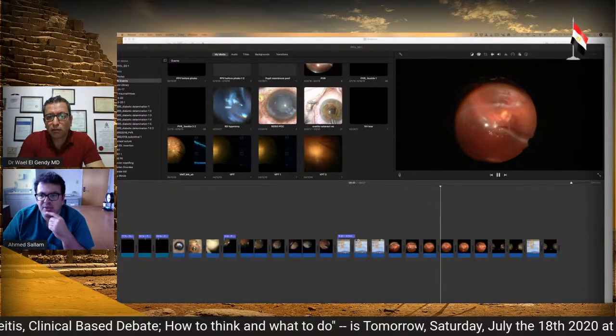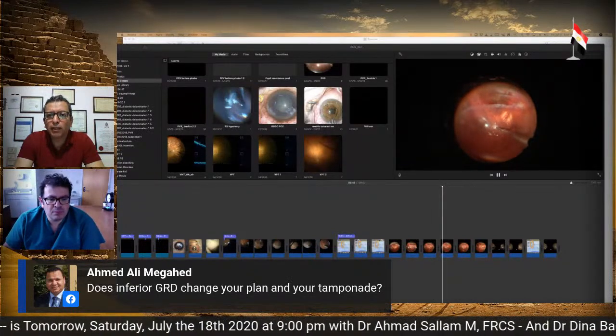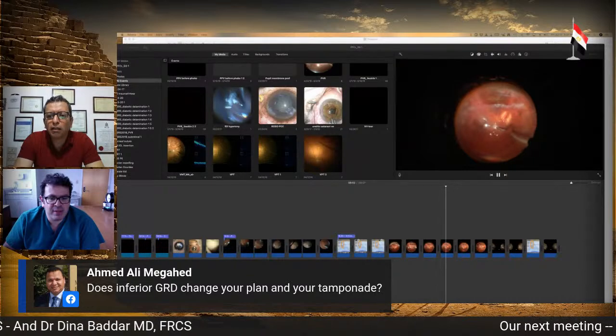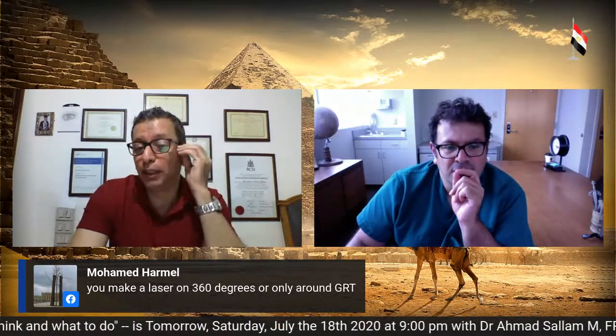Well, there are some questions here that we can answer while I get the video. I think there's a question about 360 laser. It's a live comment: do you do laser 360-degree around the giant retinal tear? Okay, I found it. No, I don't always do 360. I sometimes do it, I sometimes don't. It depends on whether I can see a pathology around it or not.